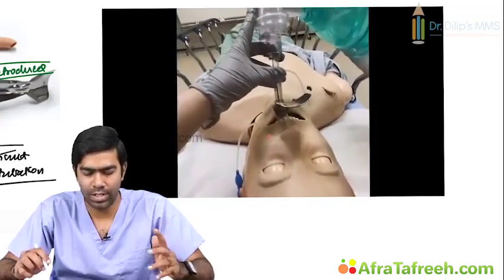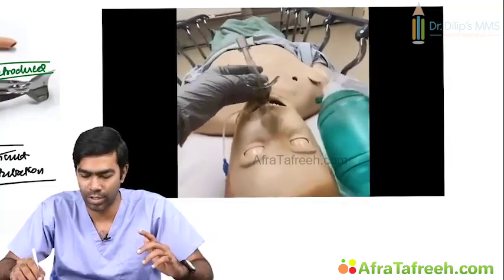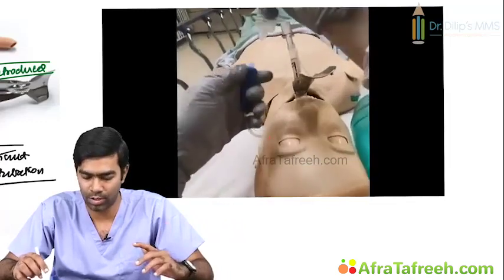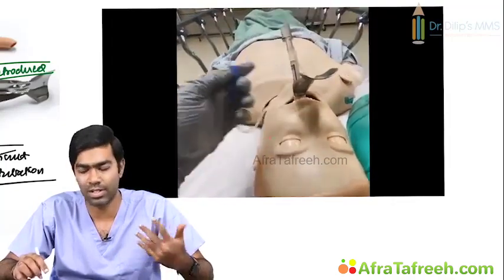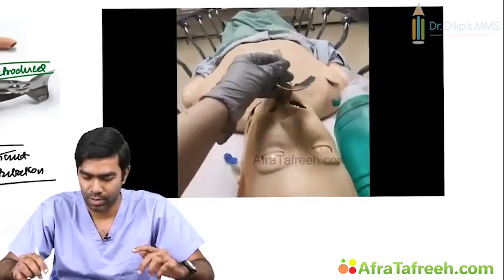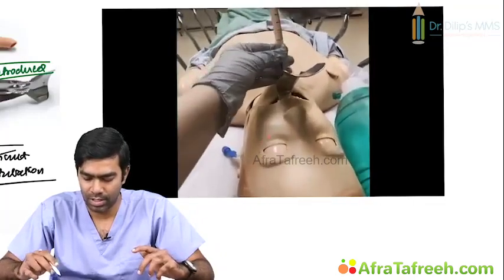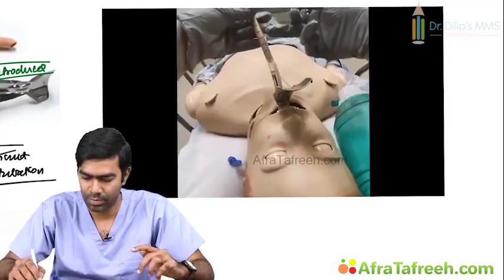So once you feel that the ventilation is good and the patient is maintaining saturation, now you can attempt to remove this LMA. Now the LMA is not going to serve any purpose from now on. So now you can remove this LMA, but the problem is when you're removing the LMA, your endotracheal tube also might come out. So you have to deflate the cuff first and you have to introduce a stabilizing rod. You have to put the stabilizing rod before removing the laryngeal mask airway after intubation is done. So that's the stabilizing rod that's getting inserted into the endotracheal tube. So now after inserting the stabilizing rod, you can remove the LMA.